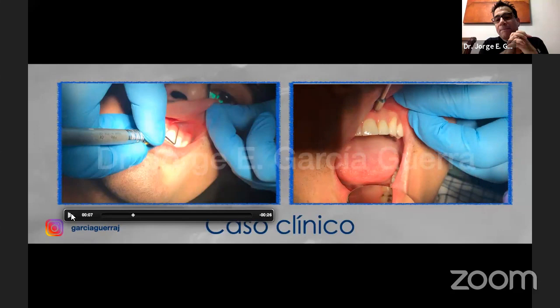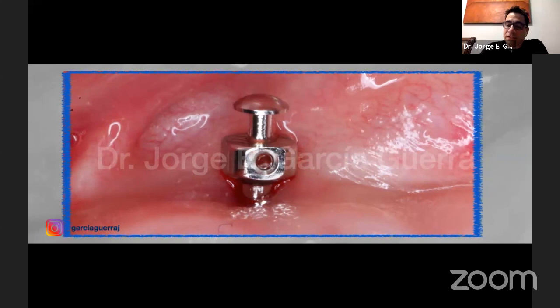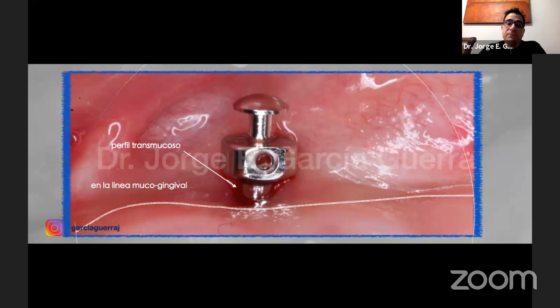Okay, let me go a little bit so we can cover this. Now it's very important, as you see, where we're going to put it exactly, between the roots, that's the transmucosal profile, and that's what is going to be in contact with the gingival tissue. So it's very important for that to be a very soft part of the implant. And we're going to put it at the mucogingival junction, okay? Just a little bit above it.